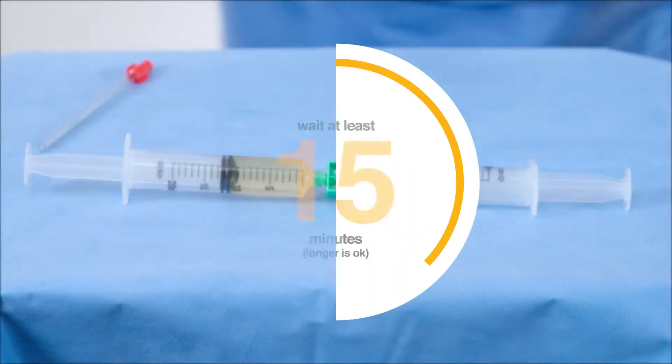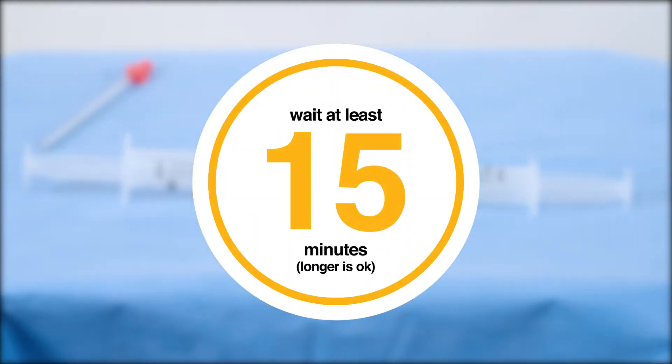Stop. The syringes must wait for a minimum of 15 minutes before they are mixed. Leave the syringes on your instrument trolley for the case duration.